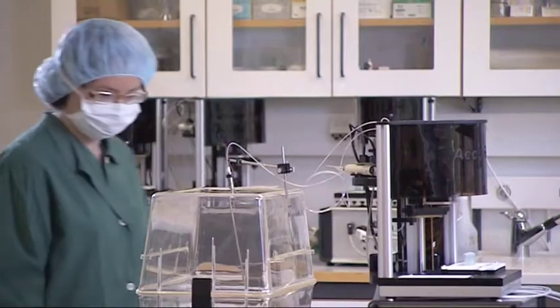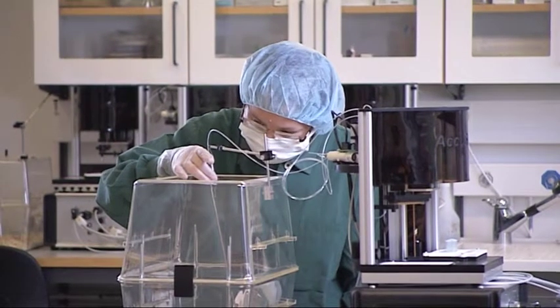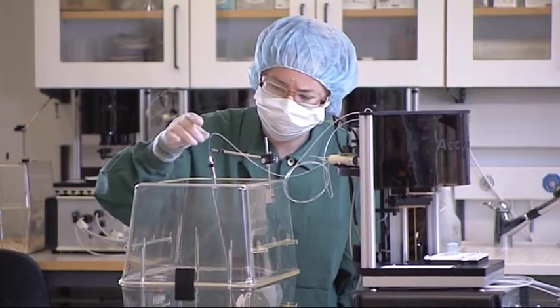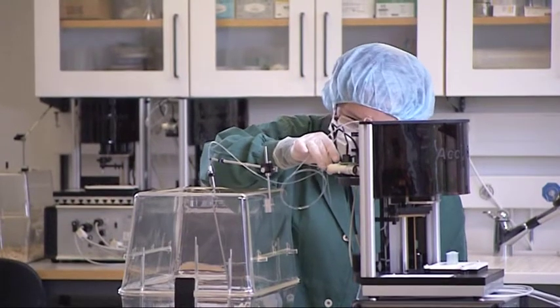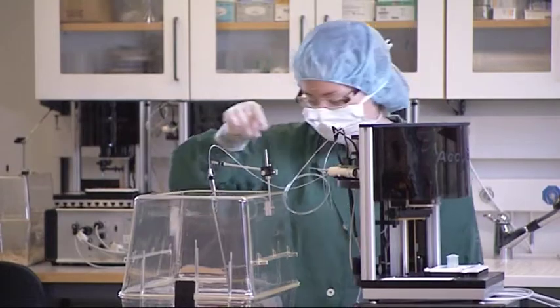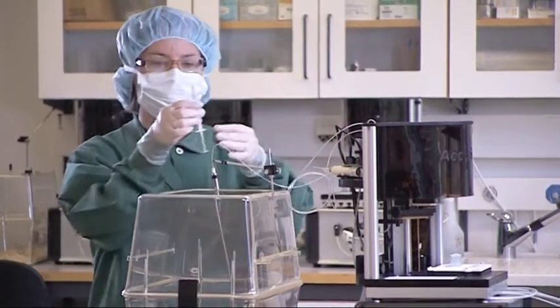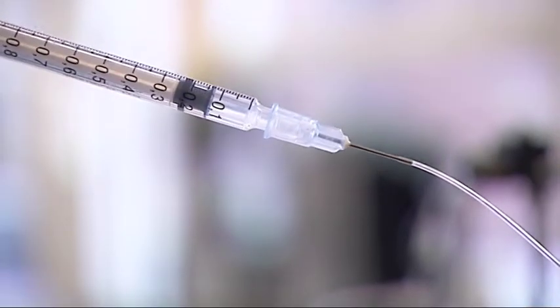The sampling starts by taking a zero sample. This is done to check everything prior to the study. With a pressure sensor, the welfare of the animal is monitored and the performance of the instrument is verified. After the zero sample, the study starts, for example by administering a drug to the animal intravenously.